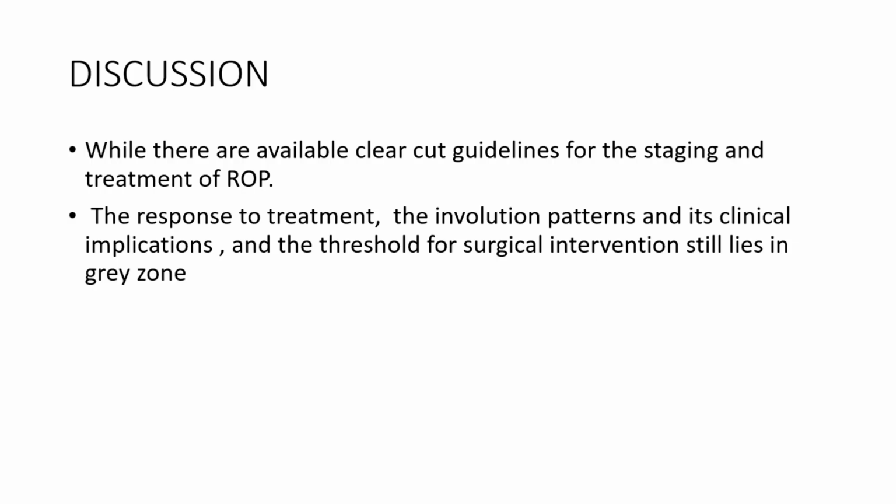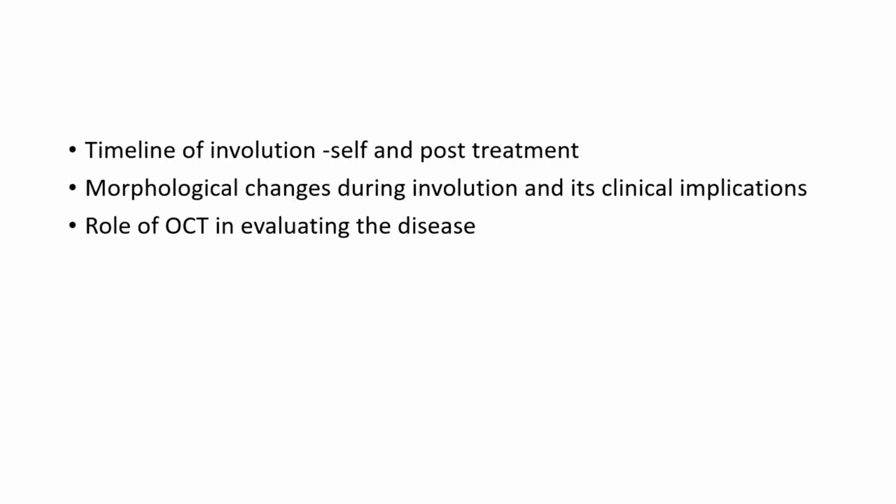So coming on to the discussion part, while there are clear-cut guidelines available for staging and treatment of ROP, the response to treatment, the involution patterns and their clinical implications, and the threshold for surgical intervention still lie in the gray zone. So here we will be discussing the timeline of involution, self and post-treatment, morphological changes during involution and their clinical implications, and the role of handheld OCT in evaluating the disease.